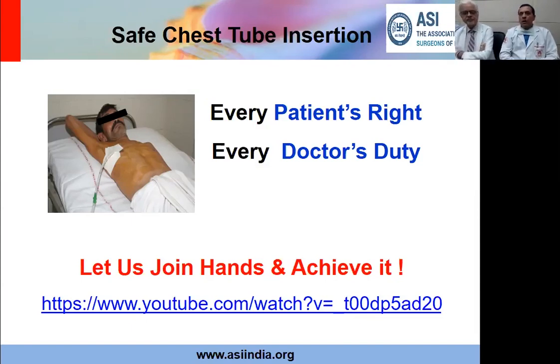Yeah, so if I look at all the chest tube insertions, the commonest indication with us has been a pleural effusion. And most of the times, it's a generalized pleural effusion. And if you want to drain this fluid, fifth space mid-axillary line provides you the best portal. Of course, the fifth could be sixth or higher, depending on the position of the diaphragm. Sometimes, if the diaphragm is very high placed, I might shift this fifth to the fourth space.